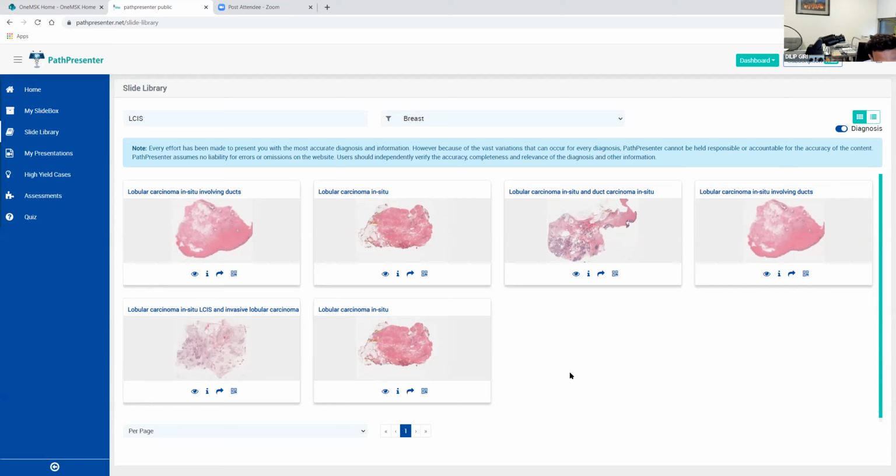Having said that, this is why it is more important for us, in a core biopsy, when you see what looks like pleomorphic LCIS, to look for any subtle evidence of invasion. Now, because pure pleomorphic LCIS is rather rare, there is not much literature on this topic.